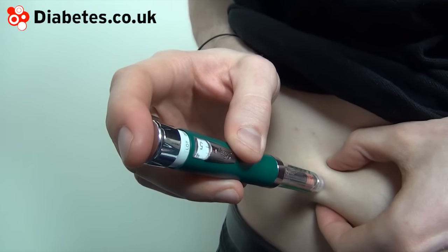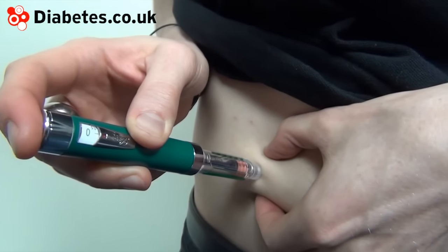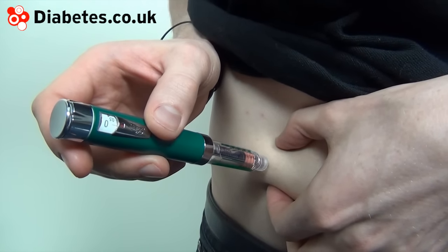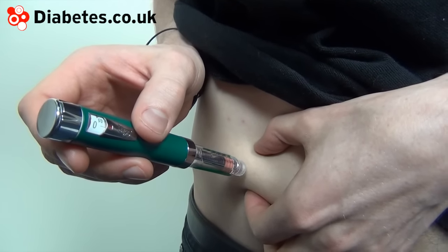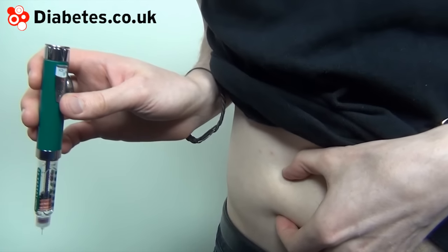Push the plunger slowly. Hold the needle in for about ten seconds to prevent any insulin from escaping. If any blood and/or insulin escapes, wipe the skin with cotton wool or a tissue.